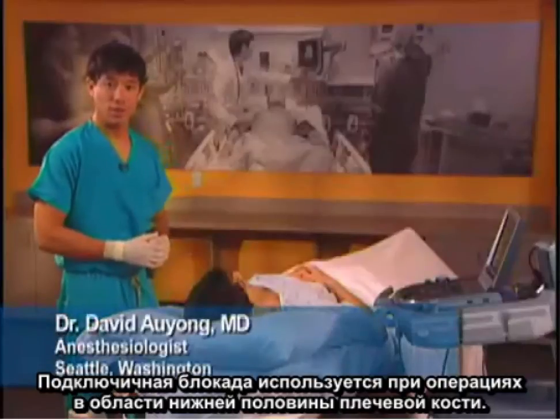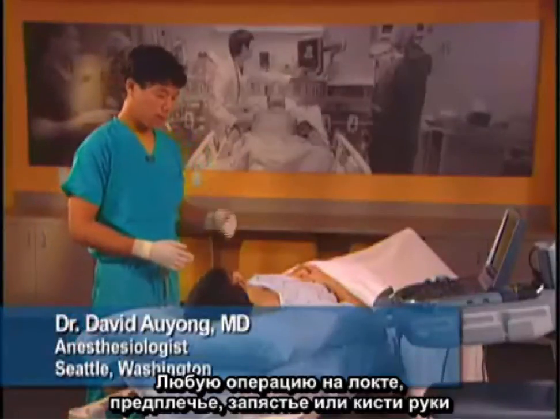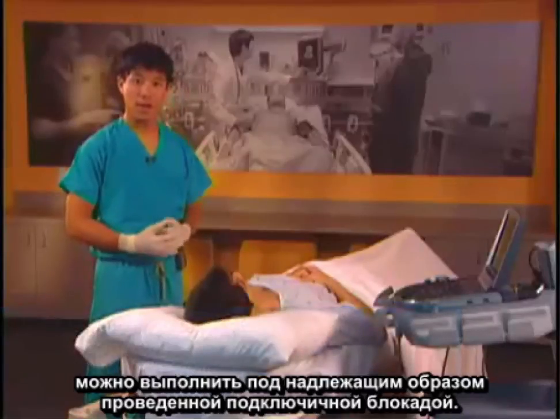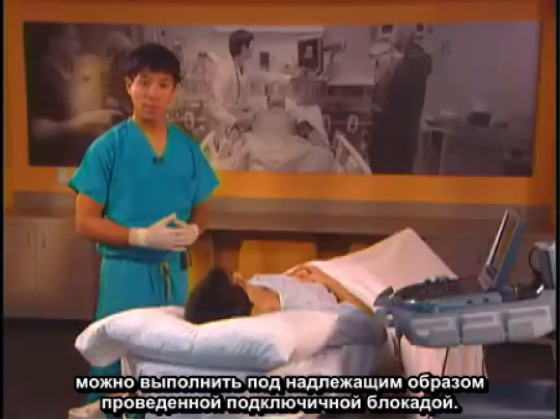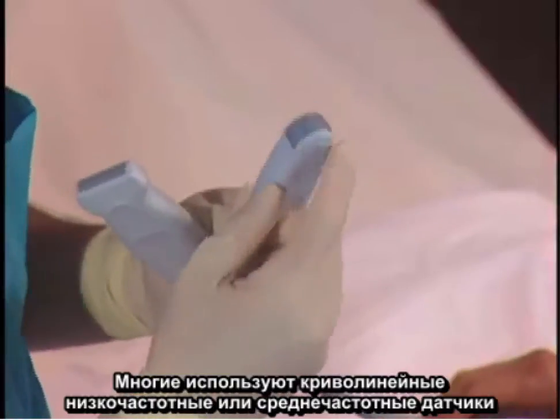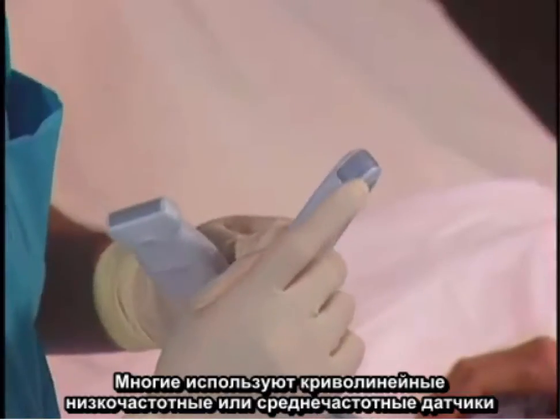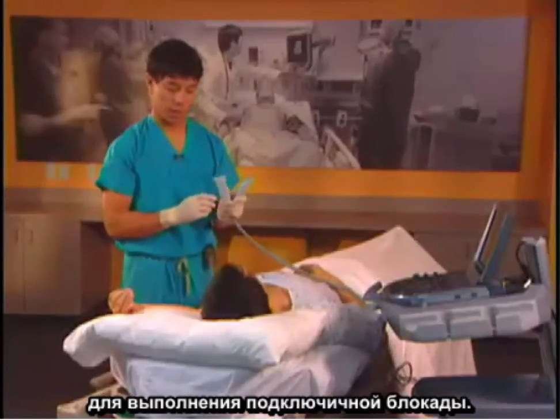The infraclavicular block is used for surgery below the mid humerus. Any surgery of the elbow, forearm, wrist, or hand can be performed under a properly executed infraclavicular block. Many people use a curvilinear low frequency or mid frequency probe to do the infraclavicular block.